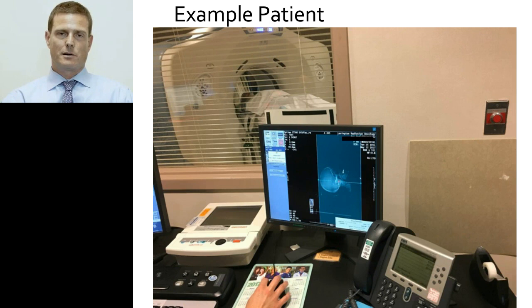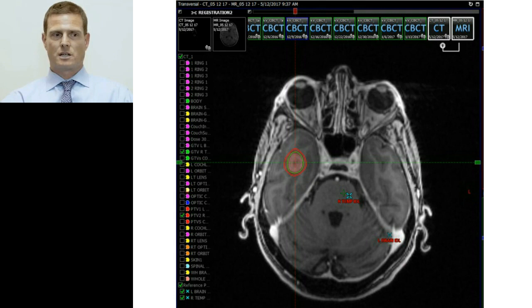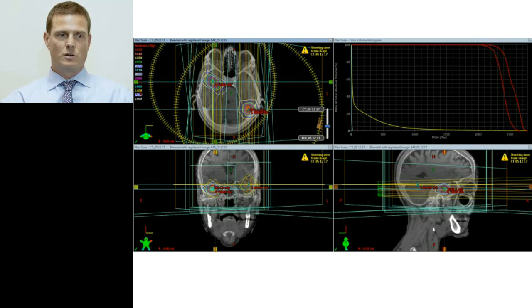And then after her CT simulation, she goes to the MRI, which happens to be right across the hall from the CT simulator, and has an MRI done in the treatment mask. There's lesion 1, there's lesion 2. There were no new lesions identified on this treatment planning MR, which was done really just a couple of days after her diagnostic MR. So then she went and had lunch with her daughter, who lives here in town, and watched a movie while we did her treatment planning.